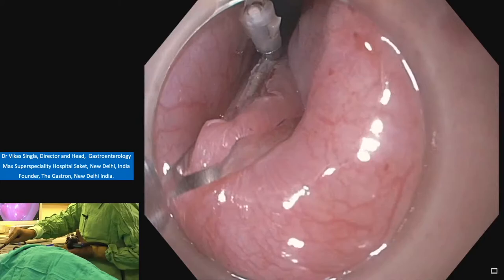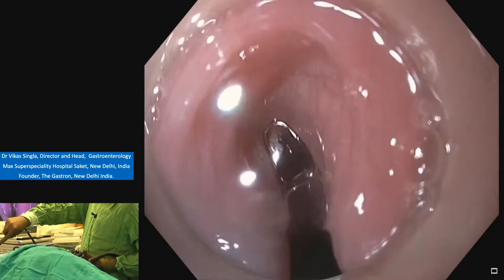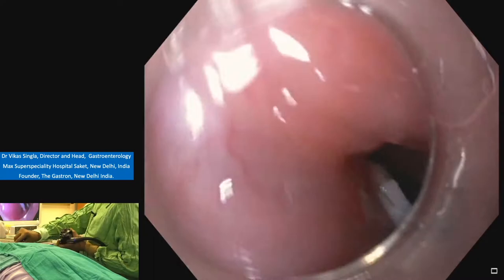Lastly, if I want to apply coagulation first, yes, fire. We have seen that we have inverted the margin, coagulation margin also. That will reduce the risk of fluid entering inside the tunnel. So we have inverted the coagulation margin. That I think increases the safety of the closure.